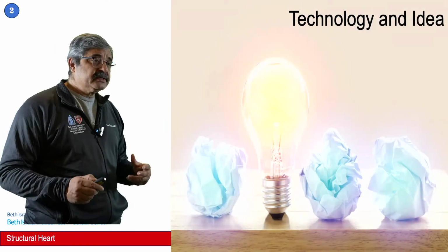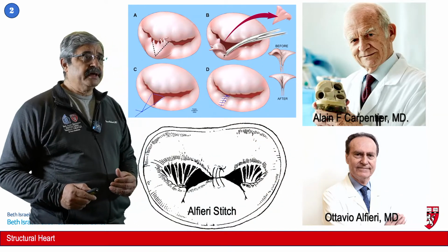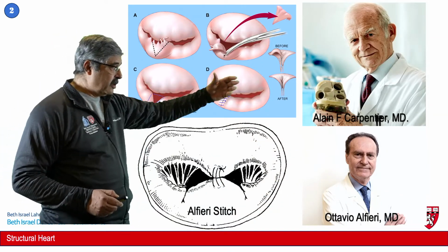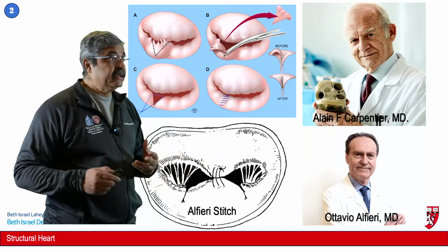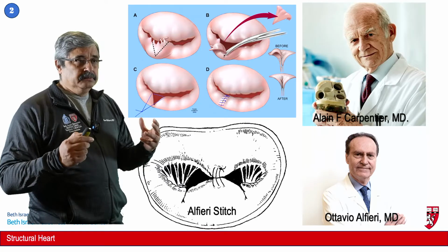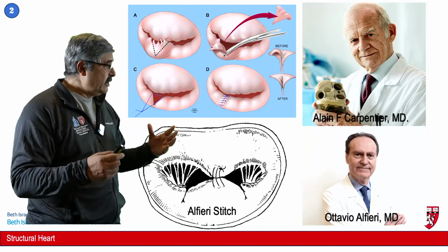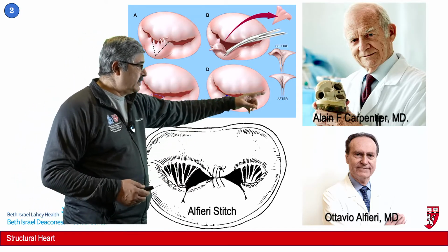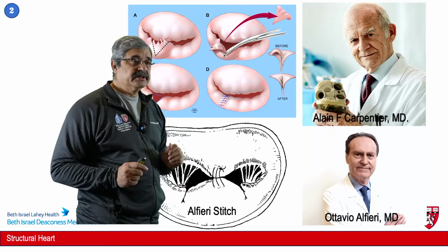So now, where did this technology and idea come from? First, let's go over the surgical mitral valve repair. That's Dr. Alain Carpentier from France, who is the pioneer of different mitral valve techniques. His techniques consisted of resection of leaflets, doing some very complicated repairs, annuloplasty devices, and then providing apposition of the mitral leaflets between anterior and posterior so that they oppose each other and there's no mitral regurgitation.